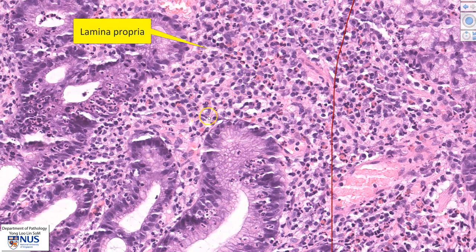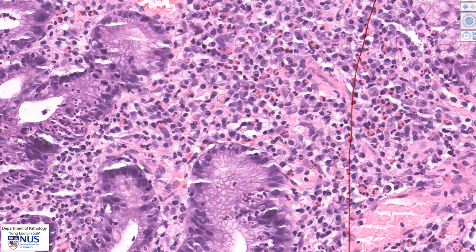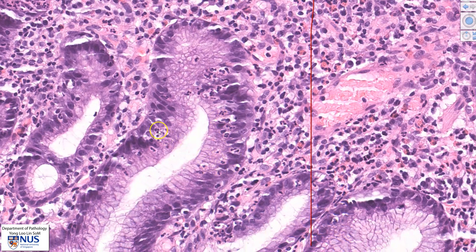Here is the lamina propria, and we can see many chronic inflammatory cells. This includes lymphocytes, plasma cells which are larger with the perinuclear pinkish hof, and occasional eosinophils with bilobed nuclei and reddish cytoplasmic granules. In addition, we can also see many neutrophils with multi-lobed nuclei sitting within the gastric epithelium.